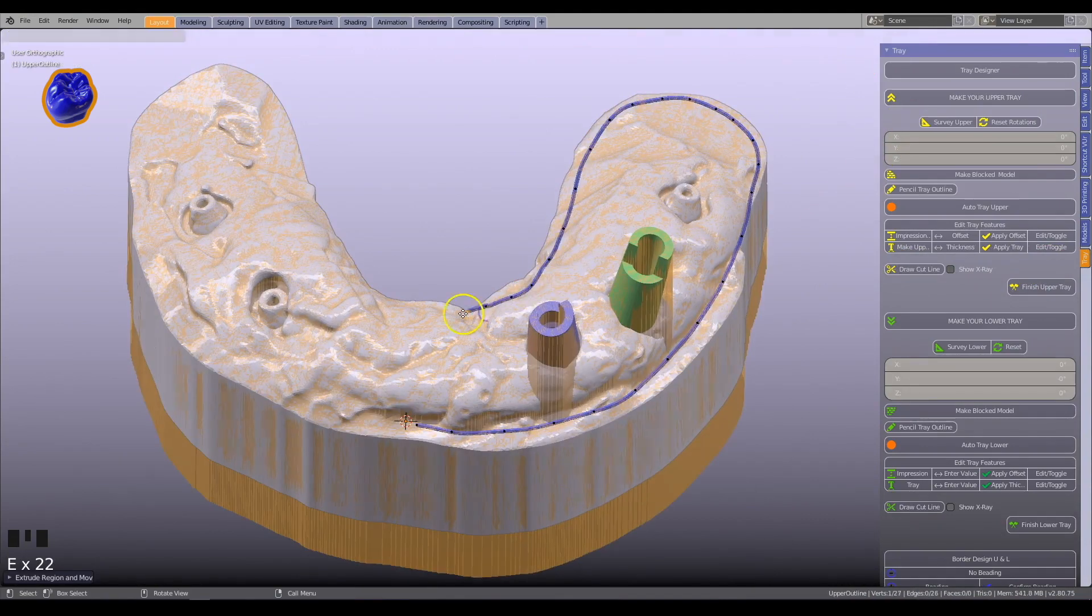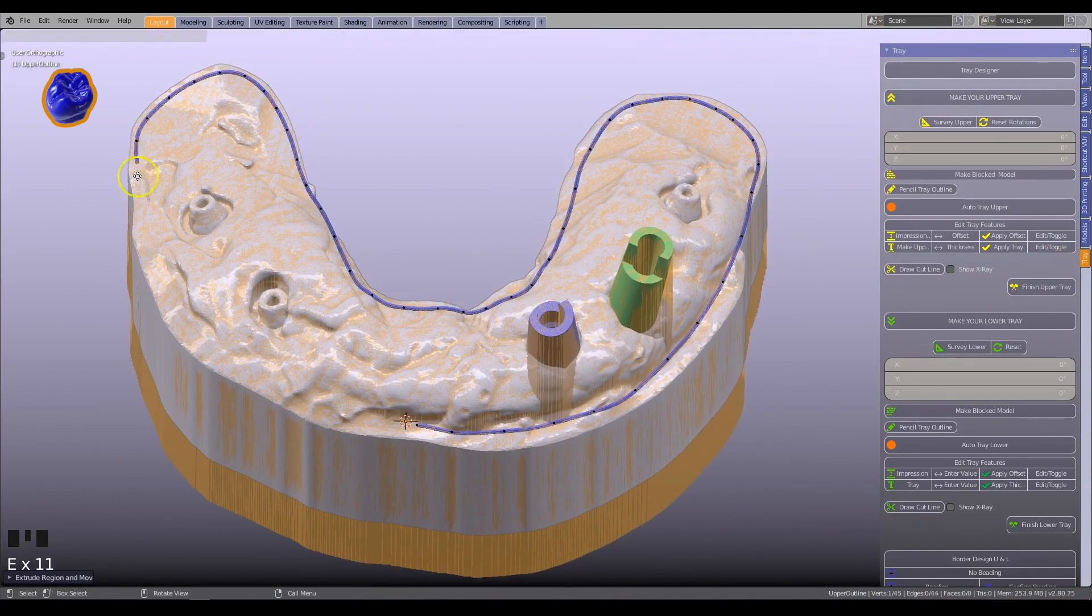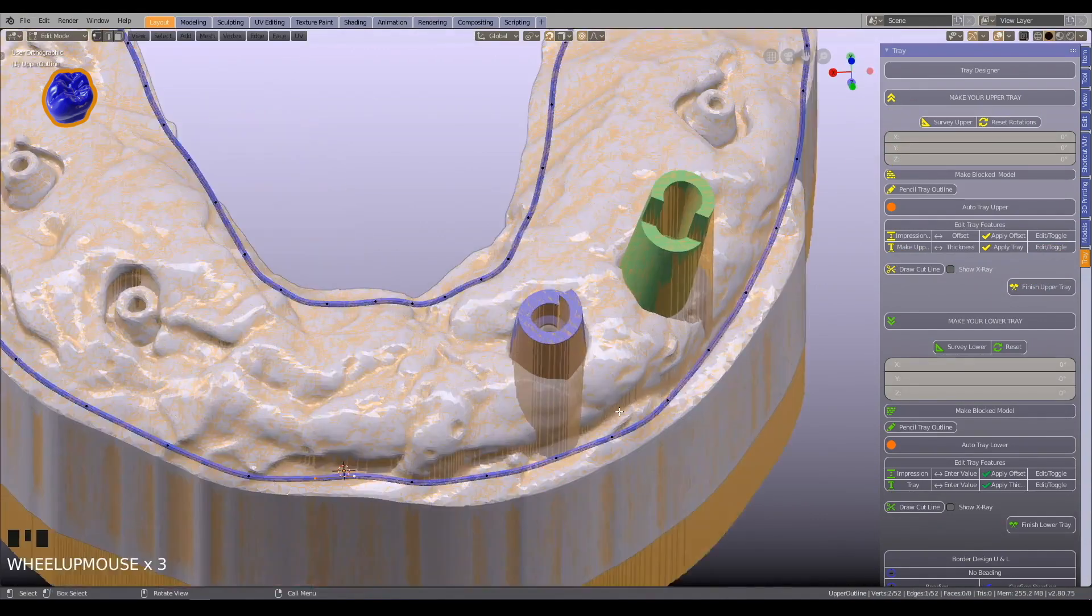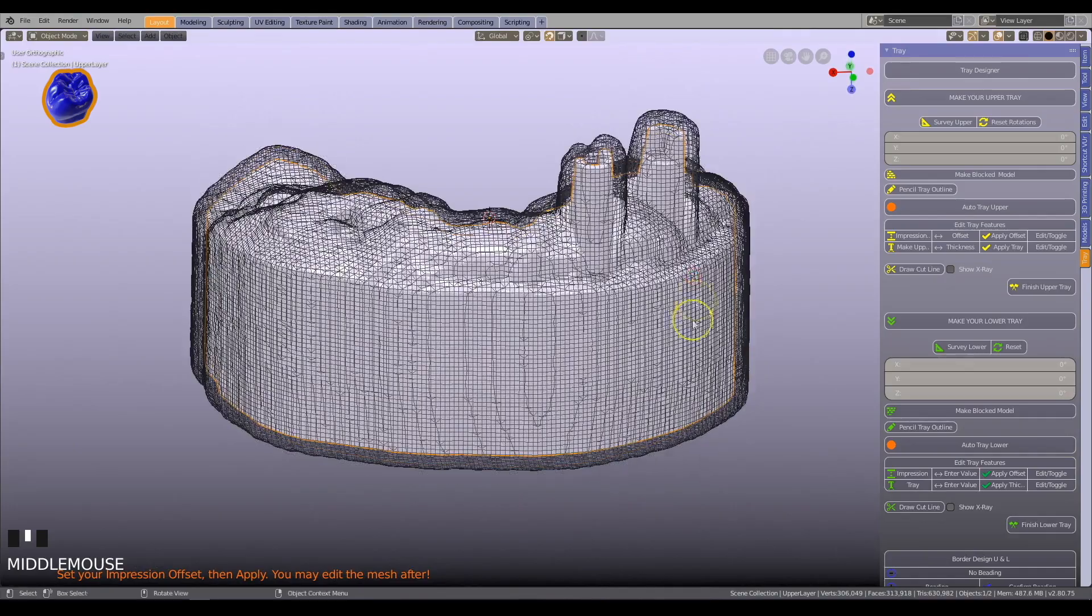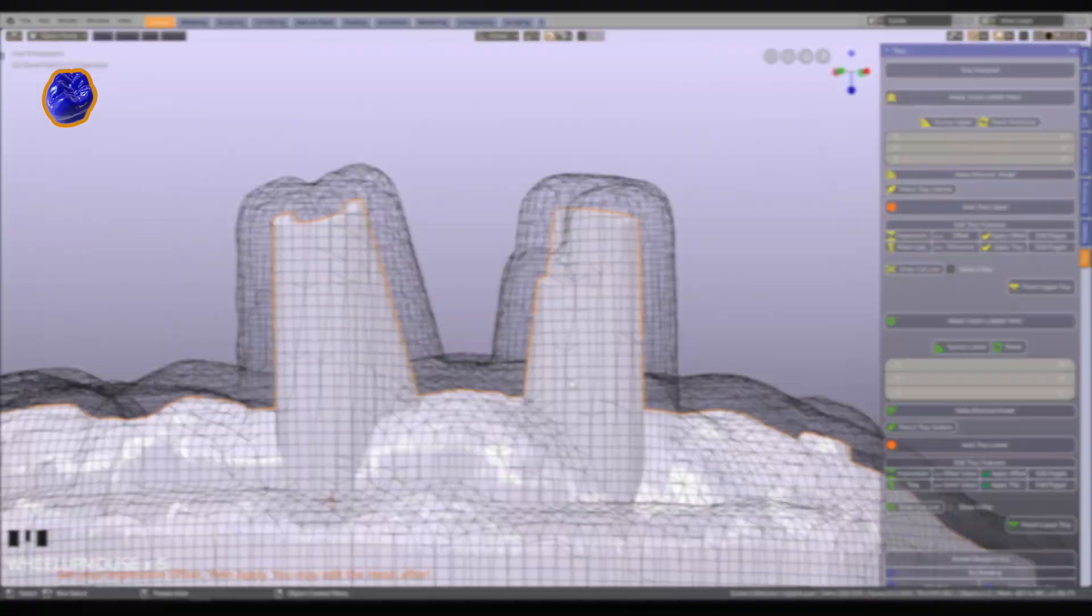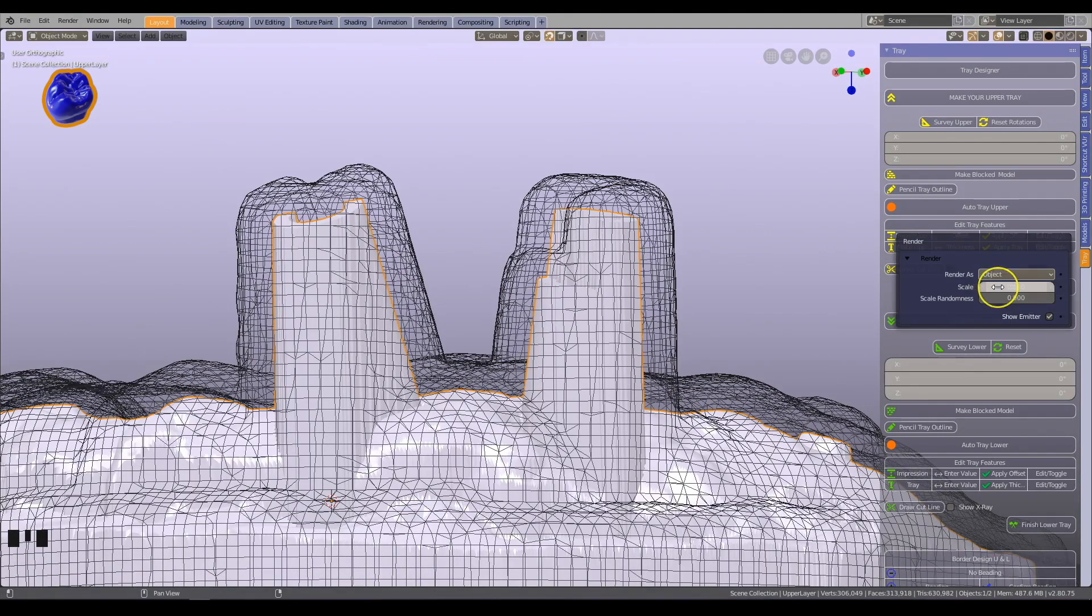Trays can be made over other objects, like implant components or crowns. Take full control over all parameters.